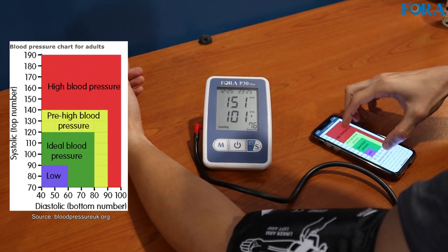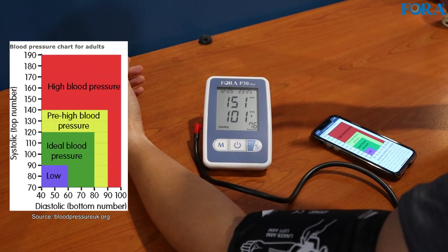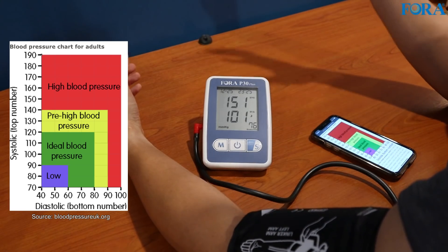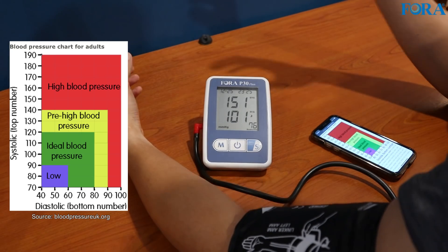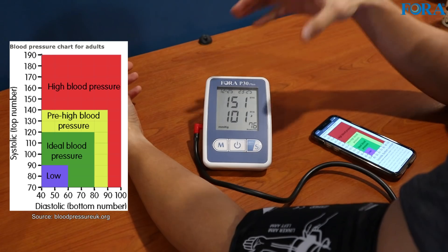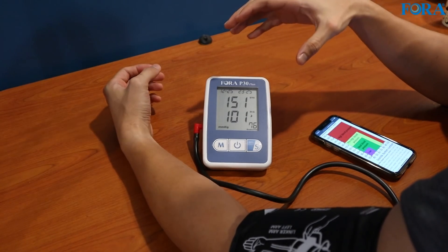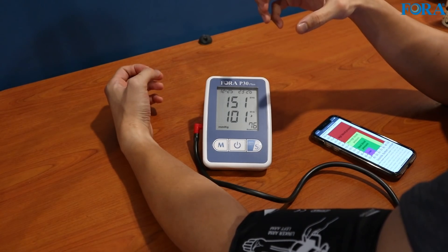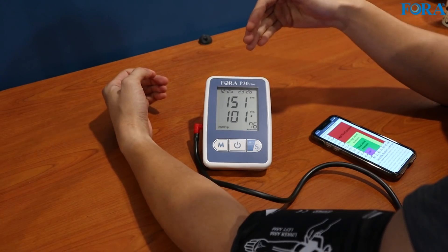That's in the high blood pressure range. But like I said, this is how I am on video — I'm also talking a lot and it's close to midnight right now, so all these factors will reflect in the result. Back to what I was saying about its silent operation: when the device is too loud, it can also reflect in the readings because it will just add more stress towards you.